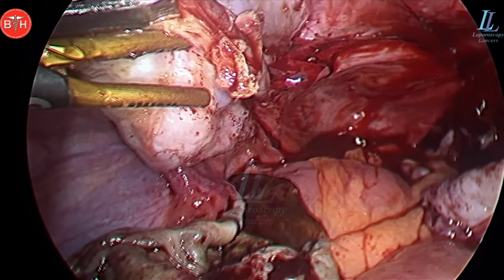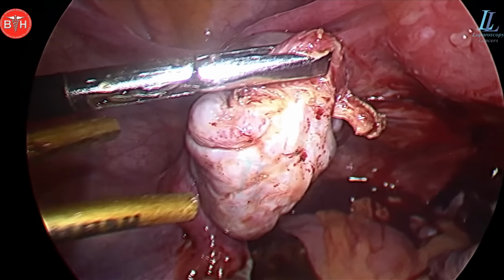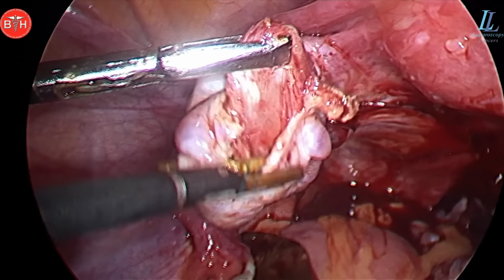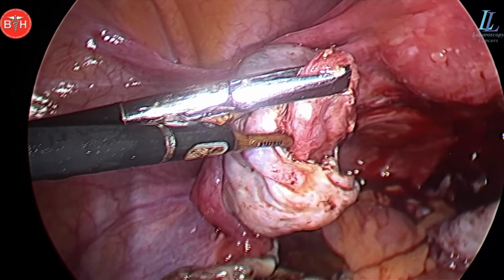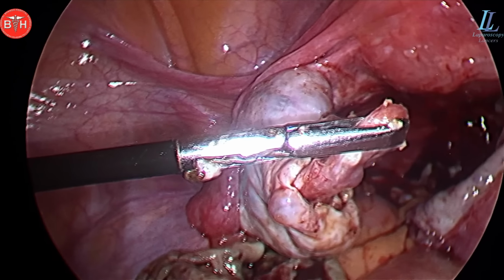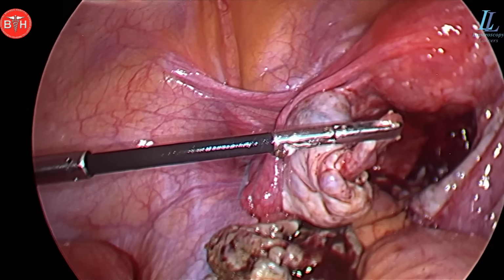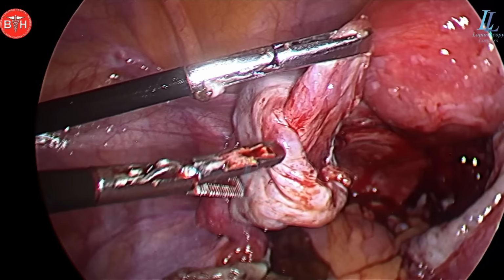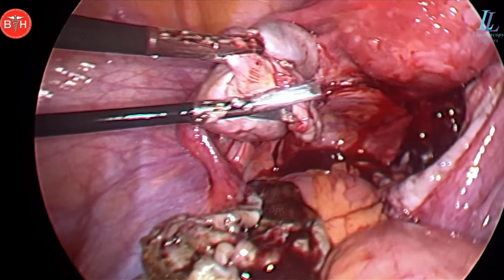Even in total laparoscopic hysterectomy, a myoma screw is never required. Please forget or leave the myoma screw for total laparoscopic hysterectomy. A vaginal manipulator from below is enough for manipulation, and even the biggest of the uteruses can be removed with ipsilateral ports. You can watch lots of videos on my YouTube channel. You can go back, scroll, and see how we take out even the biggest of the fibroids and uteruses.